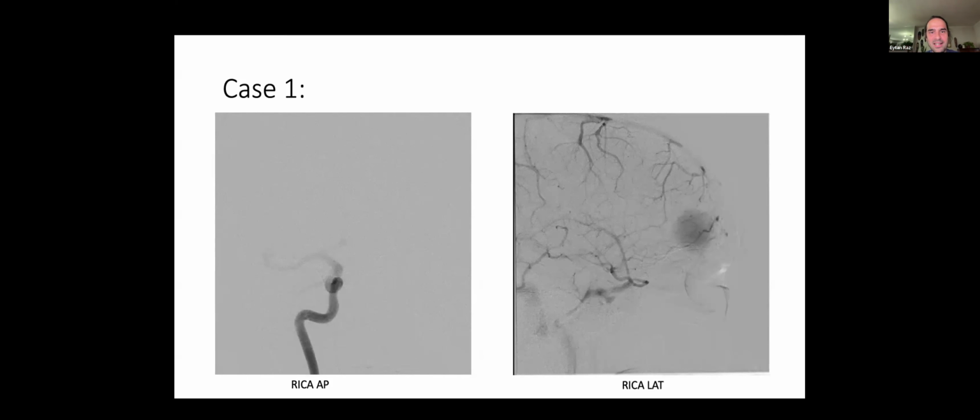I know that historically cribriform fistula has been treated with surgery, but personally I think very often we can find a very good endovascular solution. So part of it is to see, even if there's a very small supply, whether you can wedge a microcatheter and potentially cure from the external carotid artery, from whatever middle meningeal artery supply. That was my comment here.